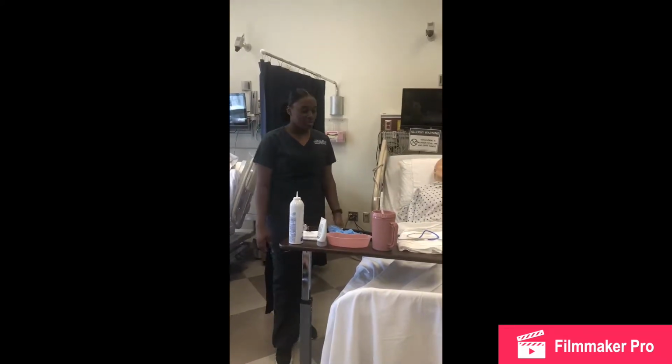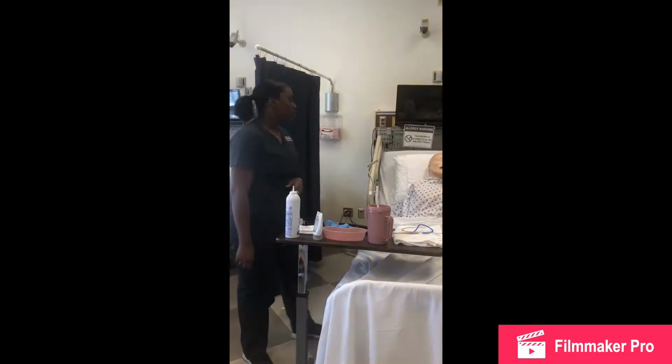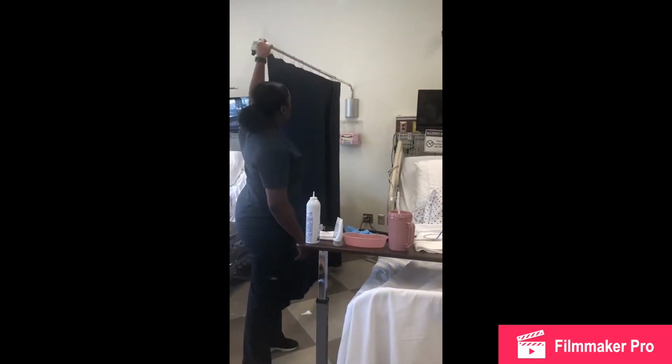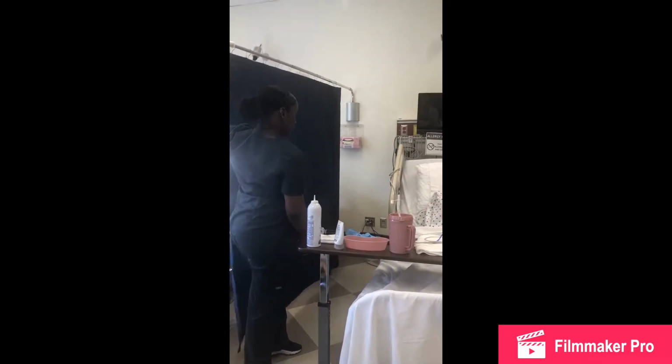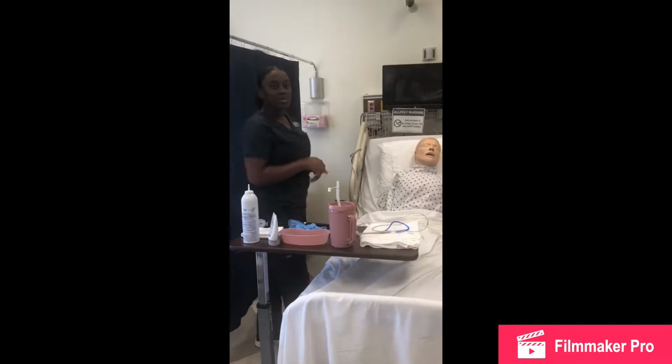Before entering my patient's room, I got all the supplies that I would need for the procedure. Entering my patient's room, I'll create privacy, wash my hands, and introduce myself to my patient.